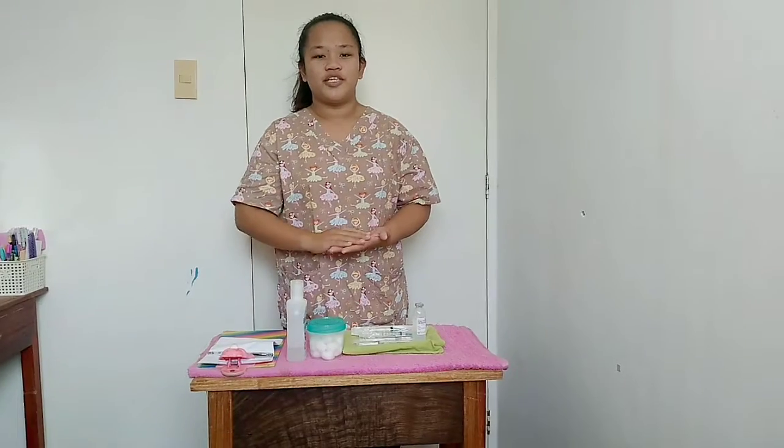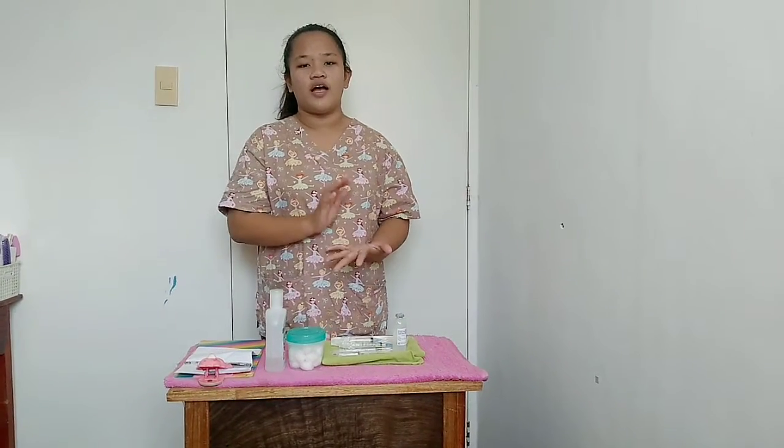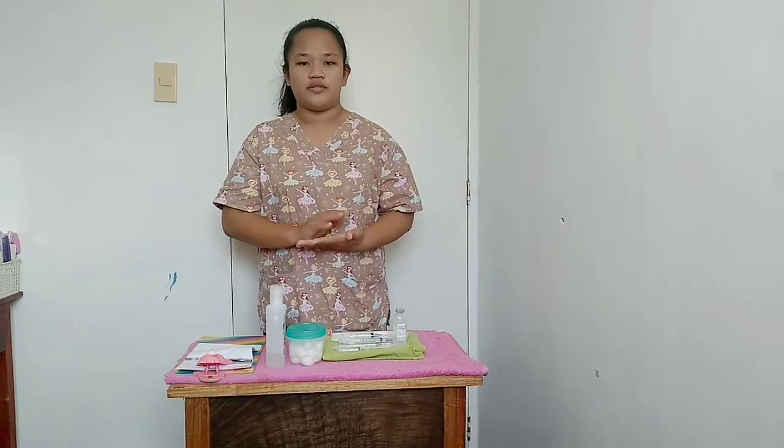Casey Ann Arde, and for today I am going to perform a parenteral drug administration return demonstration using the intradermal, subcutaneous, and intramuscular injections. The procedure that I'm going to perform is the intradermal injection.